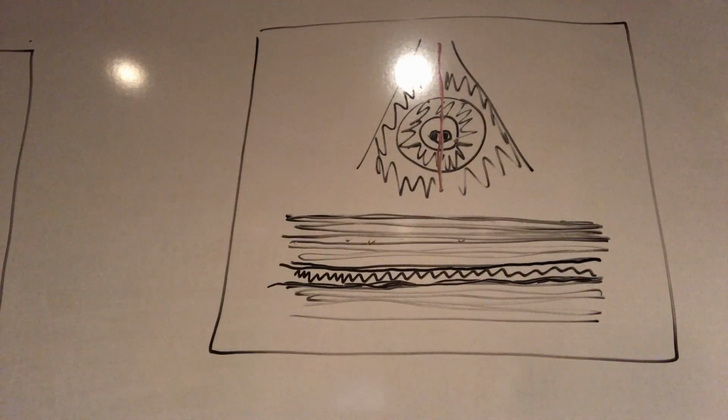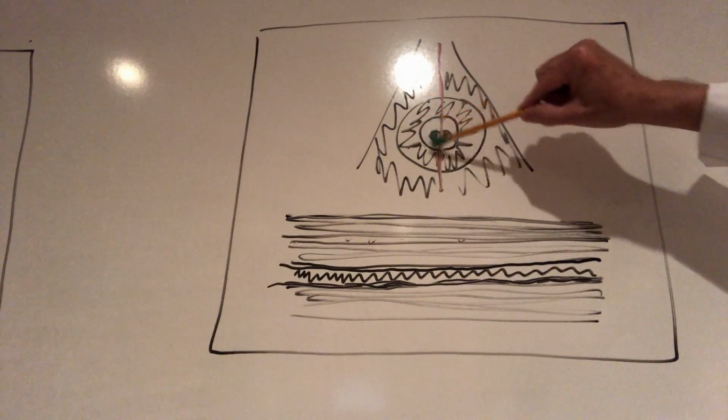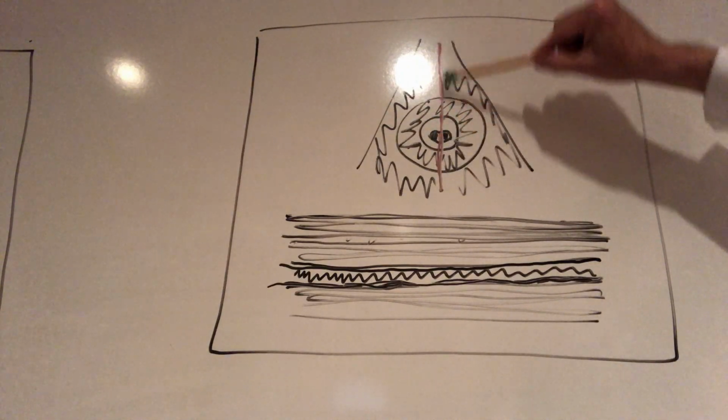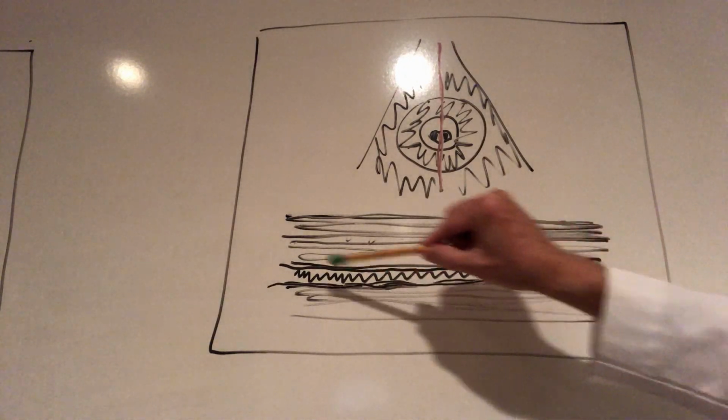We use it on early pregnancies to demonstrate heartbeat. So here's a uterus, and here's a little gestational sac with an embryo in it. You put the cursor through, and then you can see this little motion of the heartbeat.